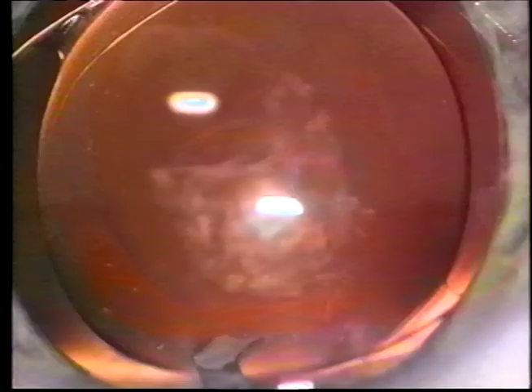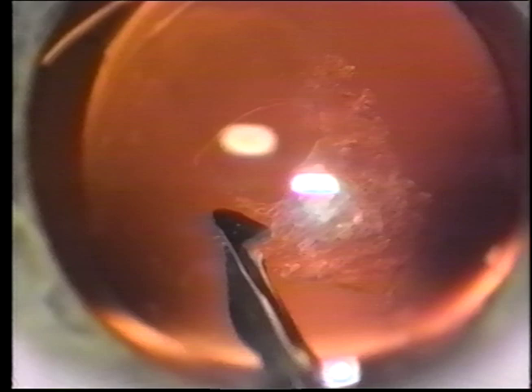The circular tear is accomplished by using CCC principles and strategies. If the flap is pushed posteriorly with the viscoelastic, the tear may be extended with the cystitome or bent needle to elevate the edge of the flap so that it can be grasped with the capsulorexis forceps. Note that the cystitome is always engaging the surface of the capsule so that it does not engage the vitreous face.